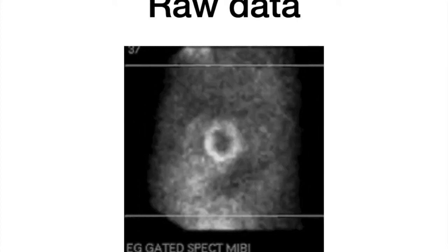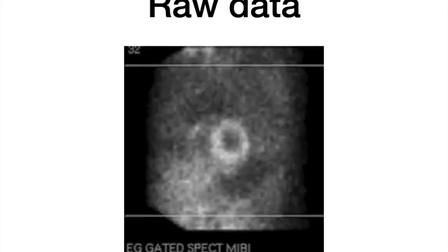In this case, the stomach is nice and empty, or the tracer may pass along the duodenum into the first part of the small bowel. You may get lung uptake, for instance, if you push the patient into heart failure during the stress imaging, which is a poor prognostic sign. And also here you can see the effect of free technetium in the salivary glands. But review of the raw data is a possibility to review for attenuation and to review for patient motion, and also this extracardiac activity and its proximity to the heart, which may all cause problems.